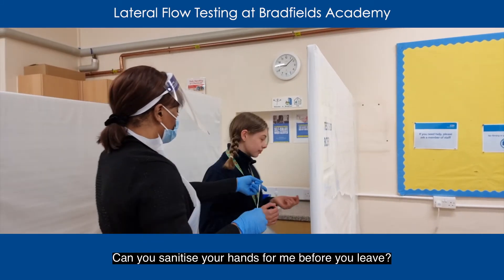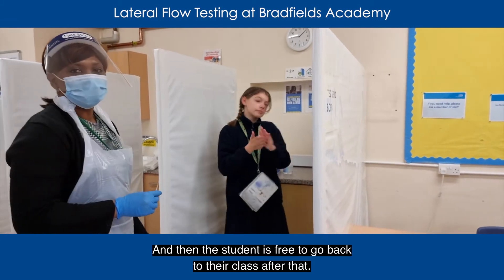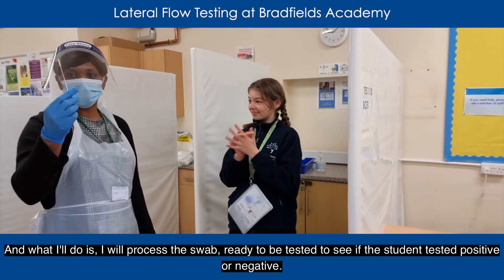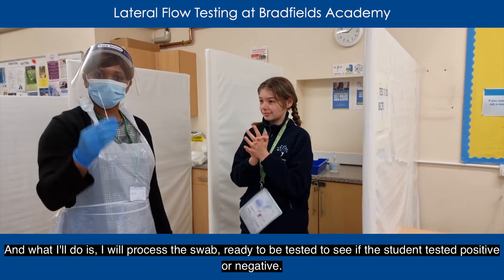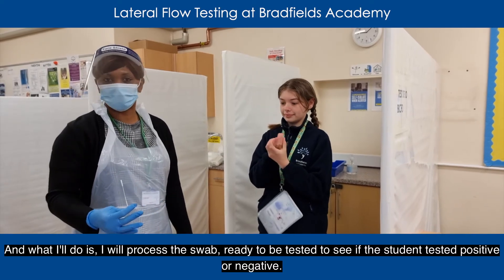Can you sanitise your hands for me before you leave. And then the student is free to go back to their class after that. What I'll do is I will process the swab ready to be tested to see if the student has tested positive or negative.